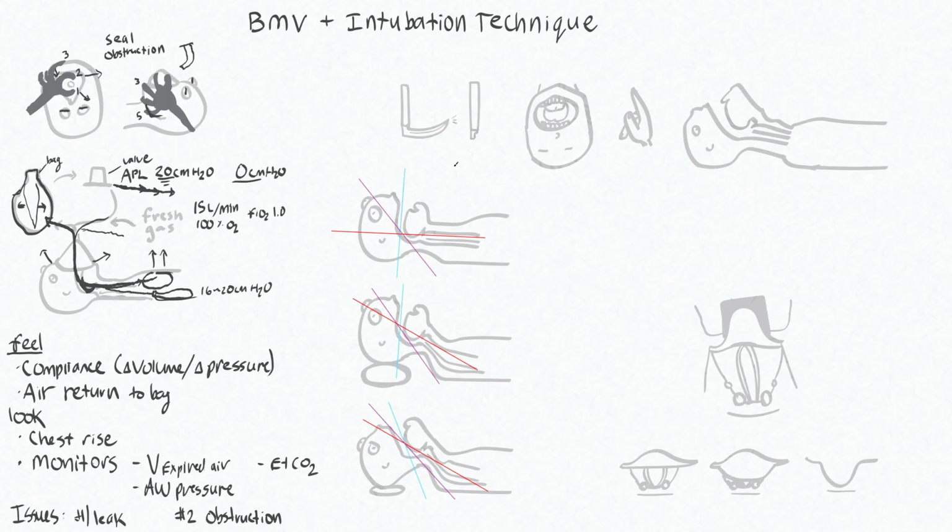Now we'll move on to intubation, and I think the first thing that we should talk about is positioning for intubation, because this can make the difference between an easy intubation and one that is quite challenging.